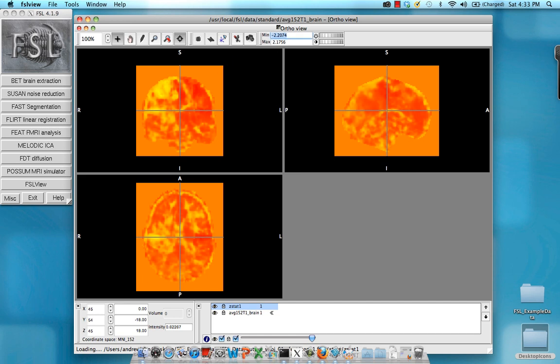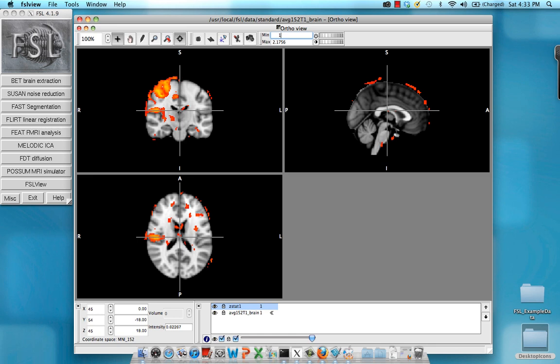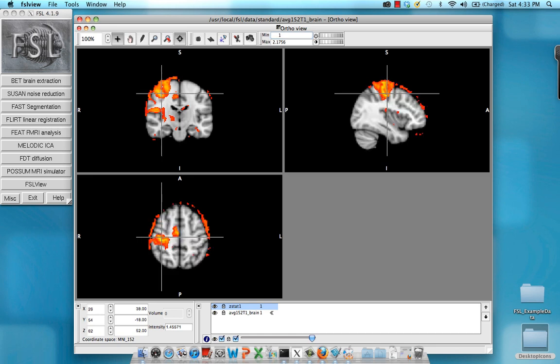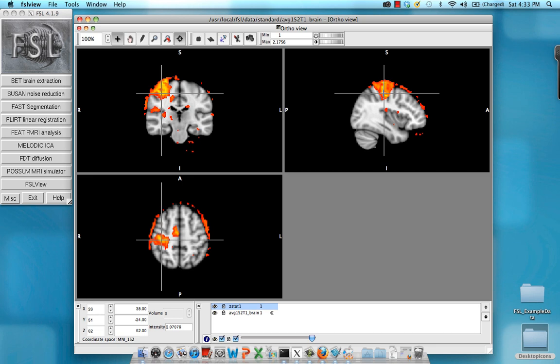All right, so I'm going to change this threshold to a lower bound of one and leave the upper bound as is. And here you can see, at this group level analysis, we do see relatively robust results in the right motor cortex for this contrast of left minus right.